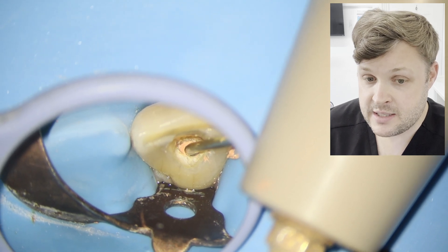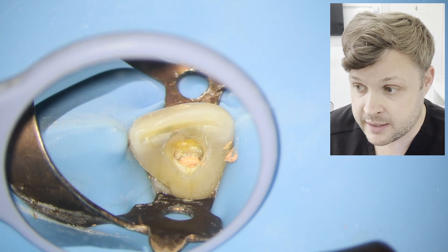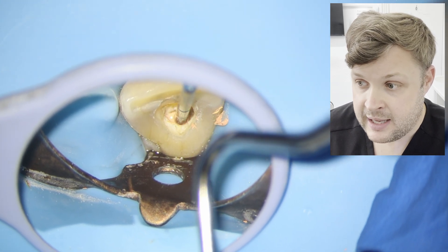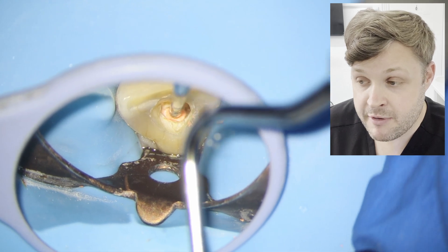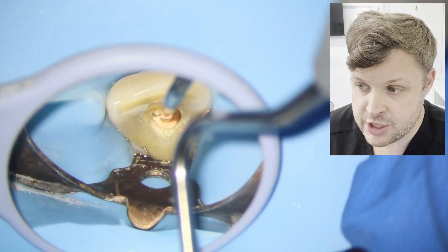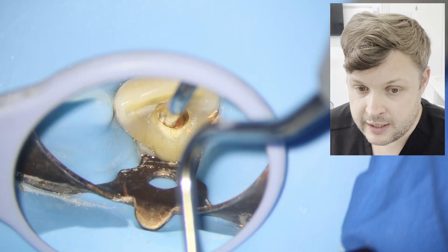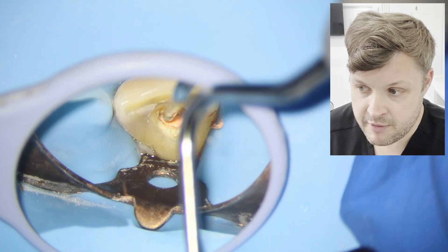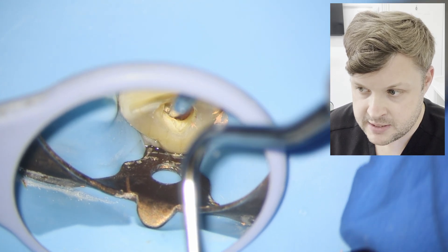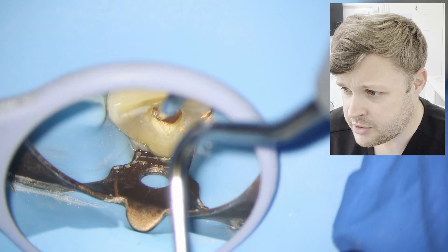This case is also going to require internal whitening, but this is a referral so I won't be doing that. I need to make sure the GP is well below the CEJ. The referring dentist has asked me to fill with composite over GIC. Personally I think GIC would be better down here, but you have to go off what the referring dentist has asked. I know the referring dentist very well — he's very competent — so I'm happy to fill it with composite over the top.